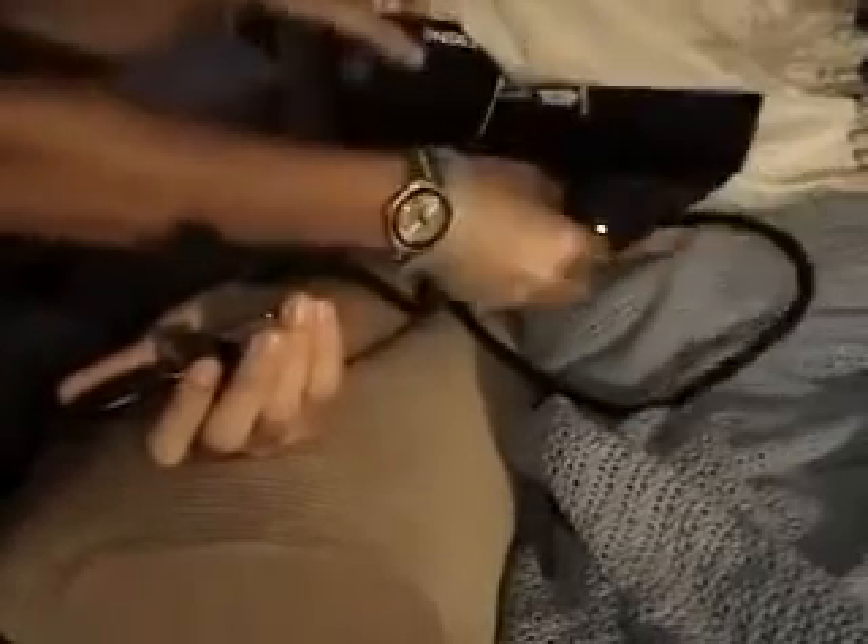The average blood pressure is 120 over 80. You're going to chart these numbers. Then you're going to take off the cuff, collect everything, and you're done — it's that simple.